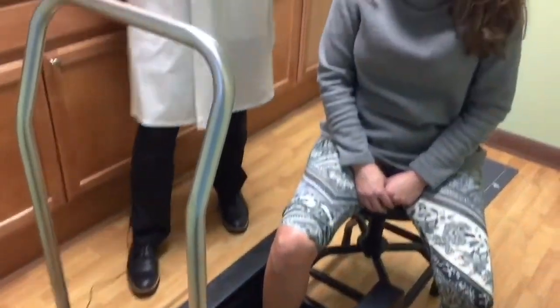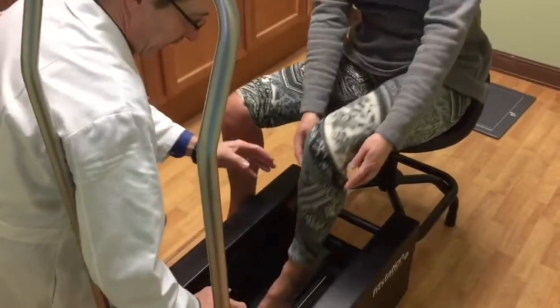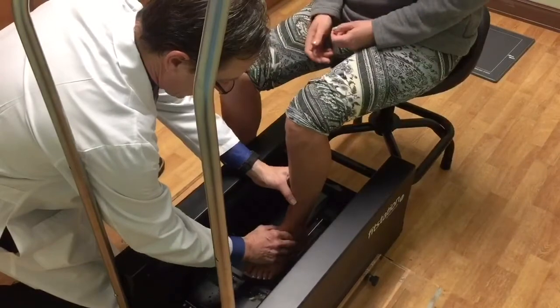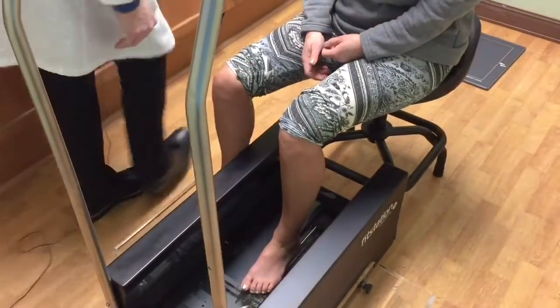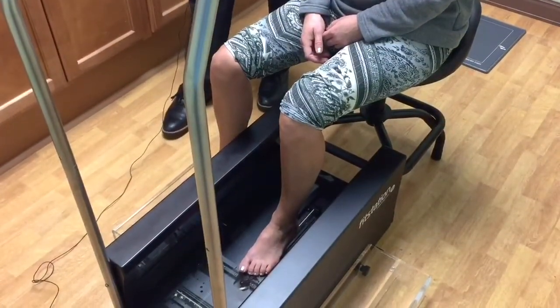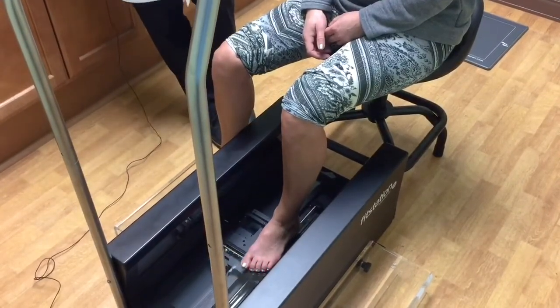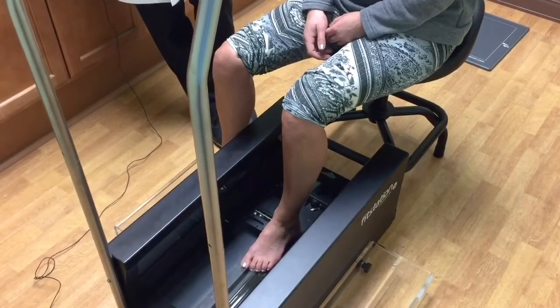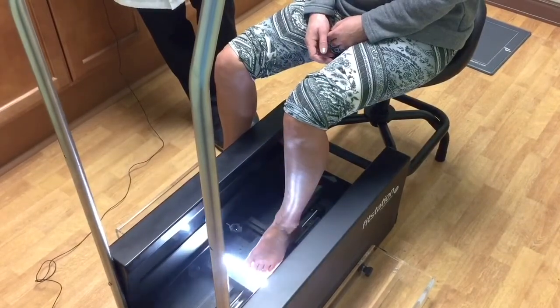Look how quick and easy. Now we're going to switch feet. The patient rotates and brings her left foot into the field. I get her into the position we need to capture the most optimal position of her foot, and we get the scan going on the other foot just like that. This is just the scan for her anatomy. The gait plate analysis, which provides a tremendous amount of data about how things function — we marry these two things together to create the best device ever.